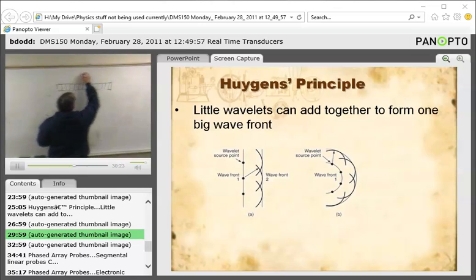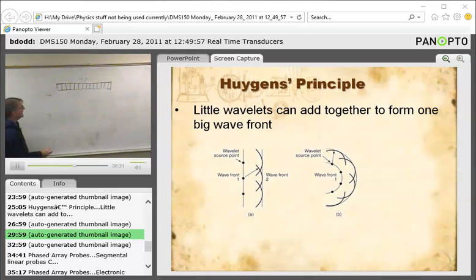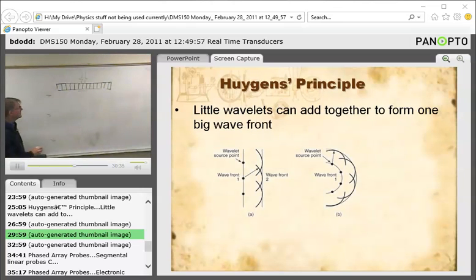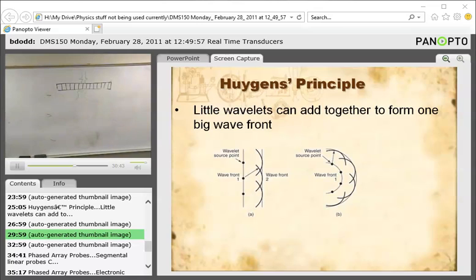So we're going to fire these two in the center. All right? And we get two little wavelets that act together as one wave. And they're going to come down and they're going to focus and then they're going to diverge. All right? You see how that works? Now, how do I get a medium? Exactly. I'm going to fire off more.